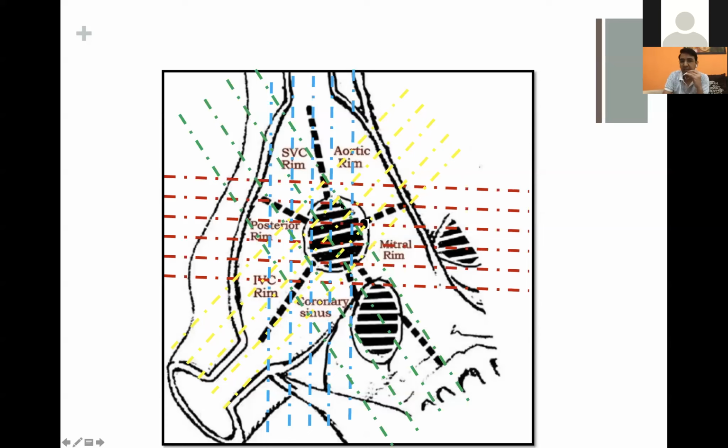Once we have a central defect like this, there is no problem. Whichever way you do it, even if you take one scan line, it doesn't matter. But it becomes important if your defect is lying like this. Then you can imagine that if you have only a single line of intersection, you might miss your longest dimensions, and you might have trouble even after choosing an apparently suitable size device.